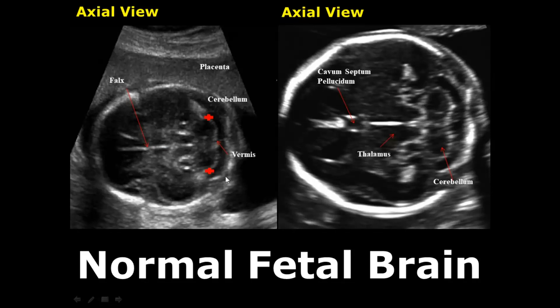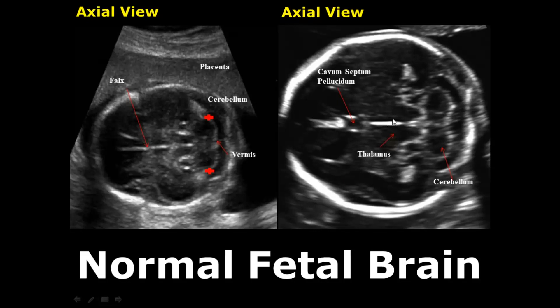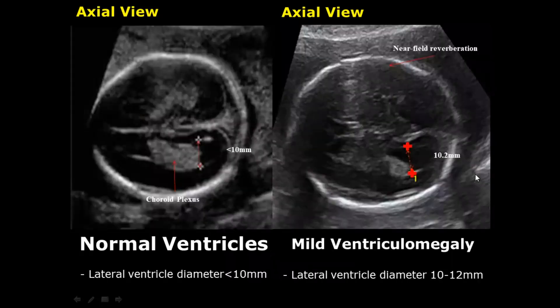In the posterior fossa, this bilobed structure is the cerebellum, and it is covered by the cerebellar vermis. At a slightly different level, this is the cavum septum pellucidum — an anechoic rectangular structure in front of the thalami. These hypoechoic structures are the thalami on either side of the falx cerebri, in front of the cerebellum.